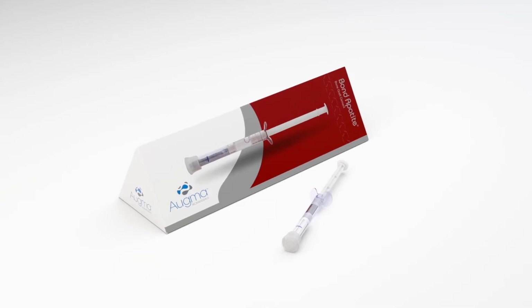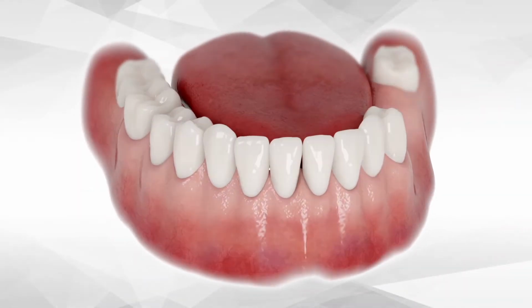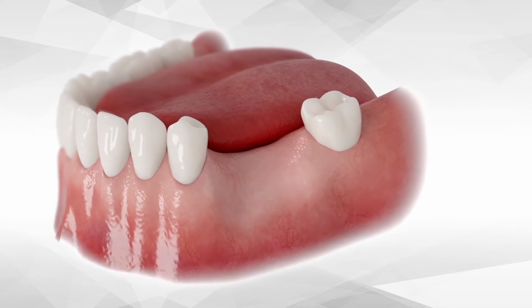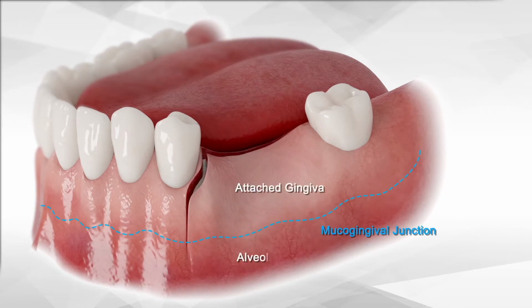This video will demonstrate the protocol for lateral augmentation using Bond Apatite. Start with a mid-crestal incision and a remote single vertical incision that should not extend into the mucogingival junction by more than 3 mm, as can be seen here.